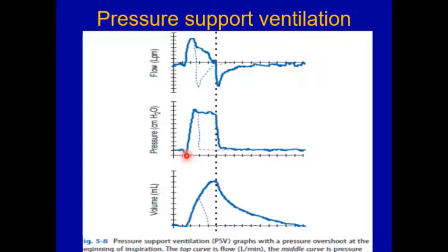Whenever it is more in a given patient, then abnormal high pressure is reached, and then the patient will go into pressure cycling. So I will repeat once again. In case of pressure support ventilation, whenever the rise time is too short, then pressure cycling occurs. That means before it reaches the given tidal volume, pressure cycling occurs.